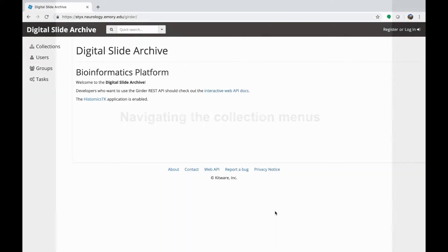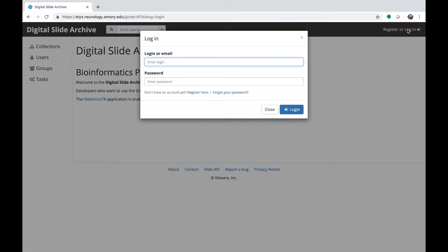First, let's look at how to navigate the collection menus and open slides in the viewport. This is the landing page you'll see when you use the URL provided by your site admin. In the upper right corner, there's a link to register and create a user account and also to log in. Just enter your login credentials at this window. There's also a link in case you've forgotten your password to request a password reset.